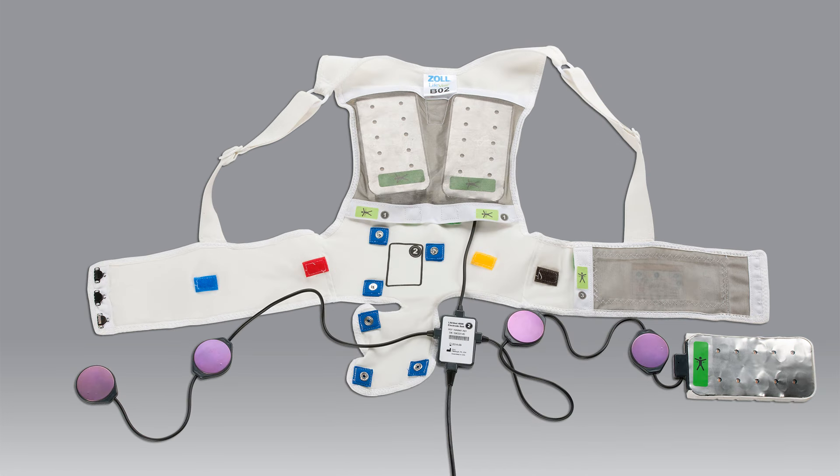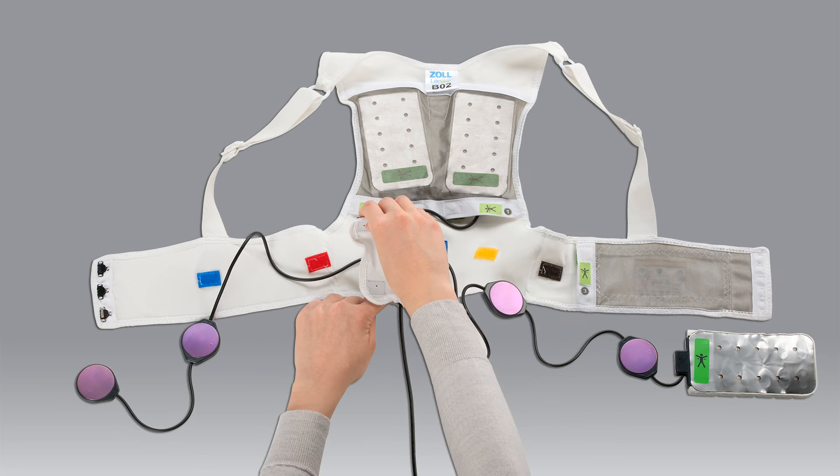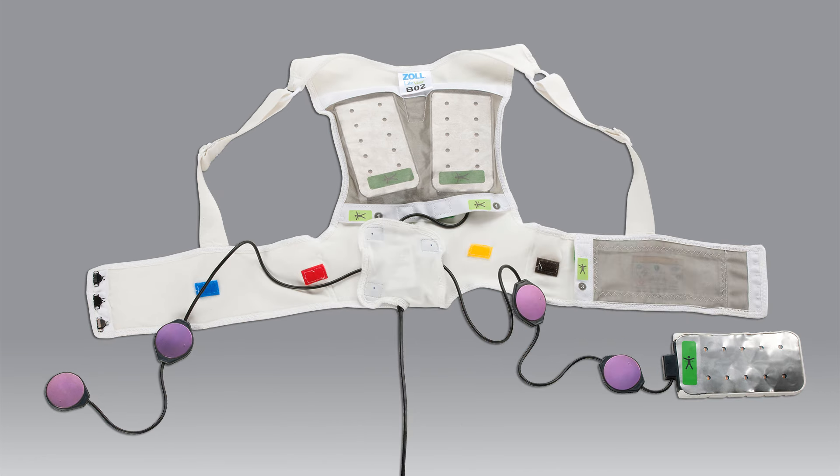The second step is to attach the vibration box. Position the vibration box in the area with the number 2. You may need to check your patient manual to see how to attach the vibration box for your Life Vest. Secure the vibration box in place by pulling the flap over it and using the blue tabs to snap into place. Ensure that all 3 snaps are securely fastened before proceeding.